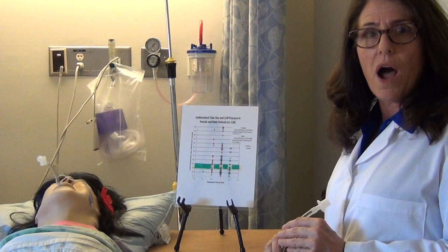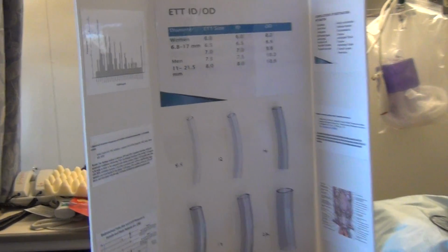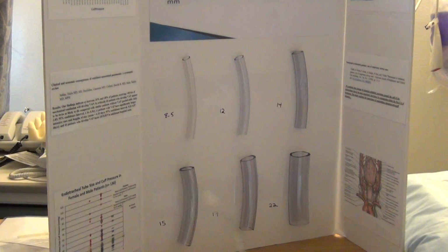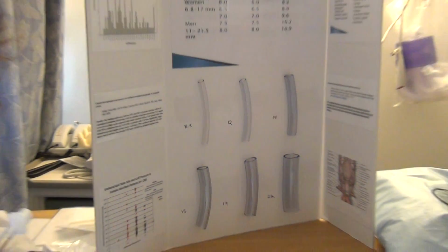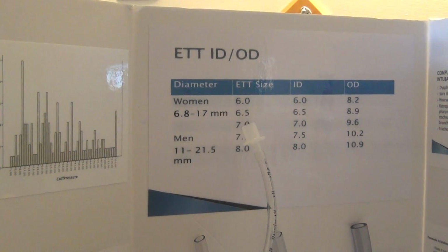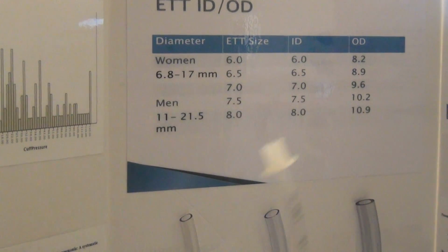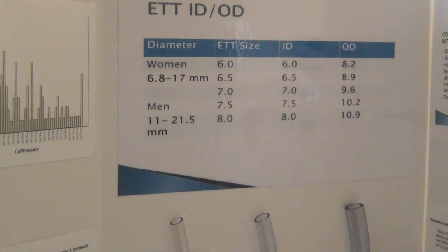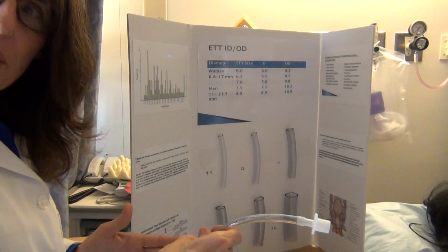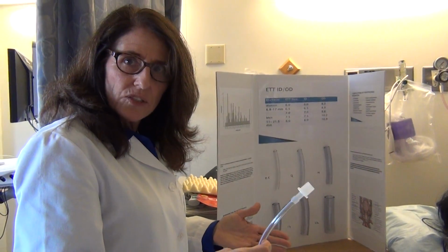Now, why are these pressures so high on females? We're going to scan over here and we're looking at 2 more charts. The bottom chart are tubing that depicts the size of female tracheas. As you can see, they vary from very small and going up to very large. It is not one size fits all. And if you go up to the top chart, you'll see routine practice is a size 7. A 7 is not the outer diameter. A 7 is the inner diameter. And what's so important here, depending on manufacturer, outer diameter of 9.6. Now just imagine large tube in a smaller trachea with the cuff pressure overextended, which cuts off the blood supply, and that leads to the scar tissue and subglottic stenosis.